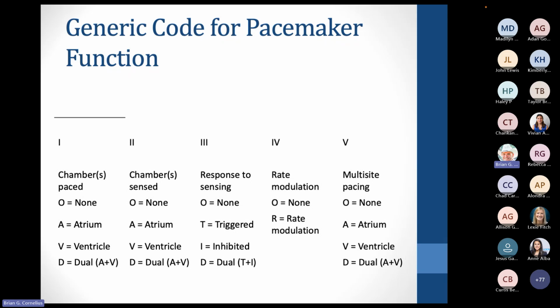Maybe it's not active. You may have a sense pacer. So what I mean by that is that instead of it being a non-demand device, it's actually on demand. So it pays attention to see what the patient's heart rate is, and then it determines its response. So you may have people, especially with ventricular pacemakers, where it's just set for a default rate. Usually it's a round number like 60, 70, or 80. So if you're looking at somebody and you see that they've got a big wide QRS and that clock regular rate of like 60, 70, or 80, be very suspicious that they may have a pacemaker, even if you don't see pacer spikes.